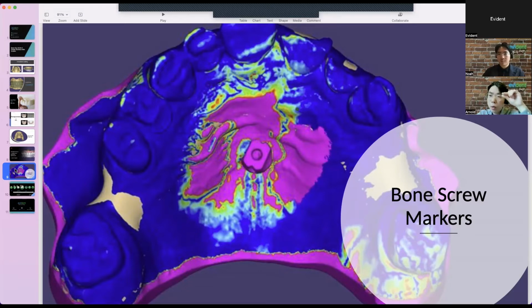But you'll still see the steps in the mesh, which means you have to polish it, and that takes time. If you don't have a polishing setup, then just let the printer print slower. It will give you a much finer, smoother result with 50 micron layers, but the printing time will be maybe 40 minutes to 1 hour. Still, it's a saver if you don't have any polishing kit. So it really depends on how you set up your in-house lab.